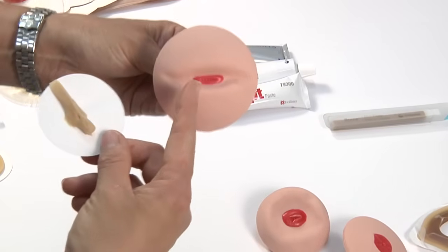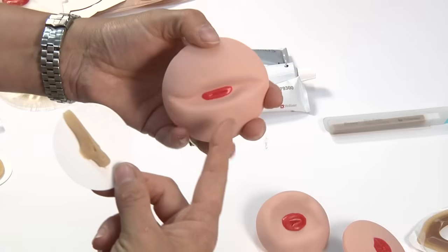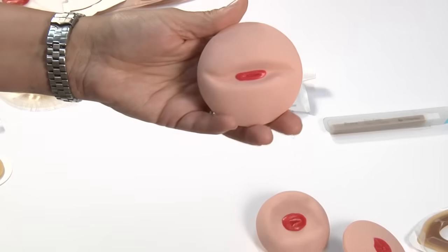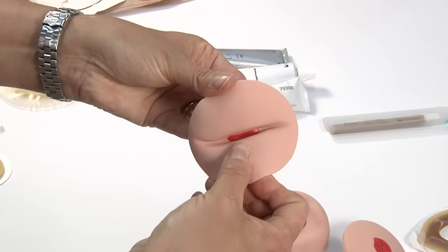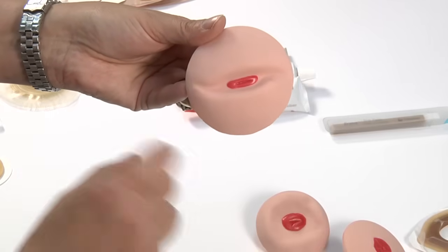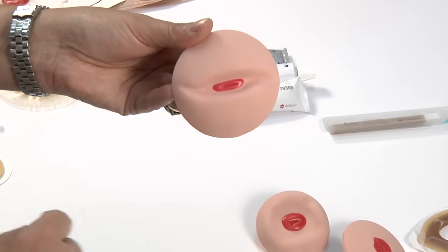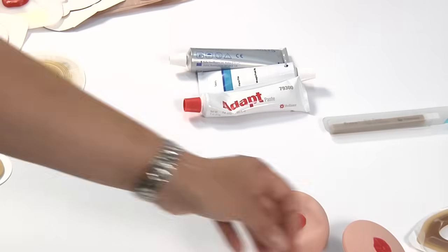So if we go back to this particular example here, if you think that you're wanting to fill in the crease here, you have to think again about what happens with that patient if they change position. And if you've got a soft pliable paste in there, it may not actually prevent the erosion that you're looking for. So you might want to be looking for an alternate.